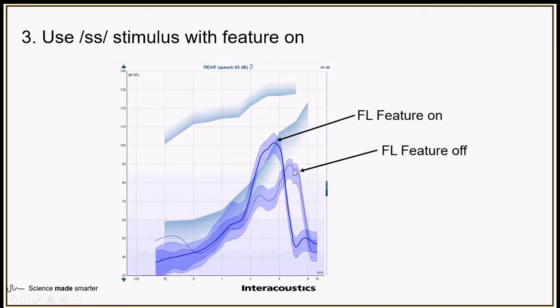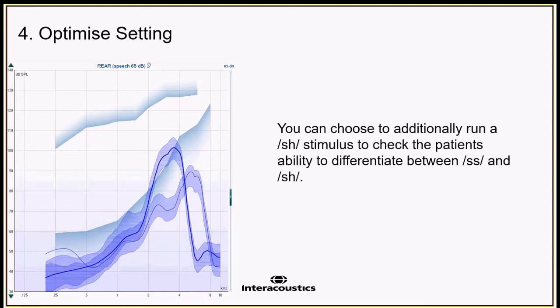And what we can see instantly is this signal, which we played here before, is being moved across and lower into a lower frequency area to give stimulation in that area that we identified. And this is what we want to see, really. Basically, the signal is changing its shape. So the input is the same, but the hearing aid is processing to play a slightly lower frequency output, which is actually falling in the patient's audible range, giving them detection and the ability to hear this type of sound. We then go ahead and optimize this setting.